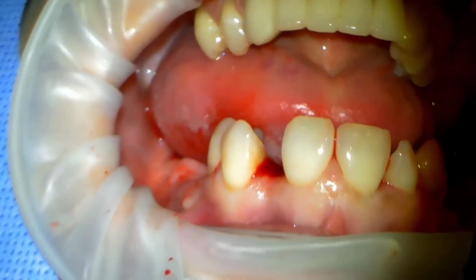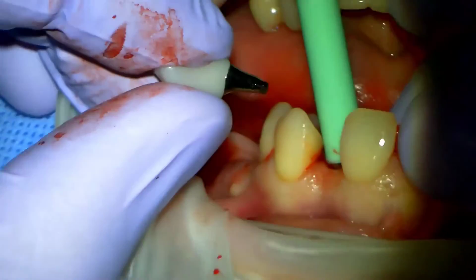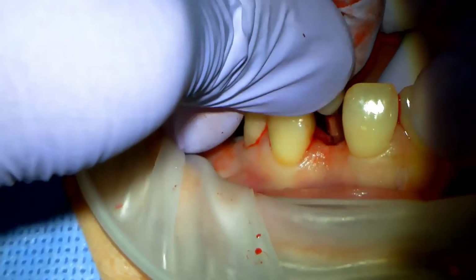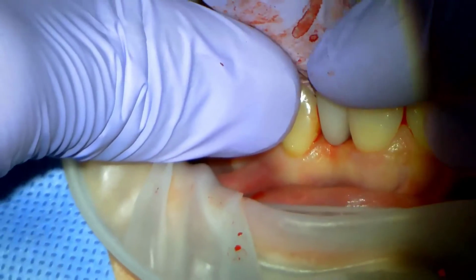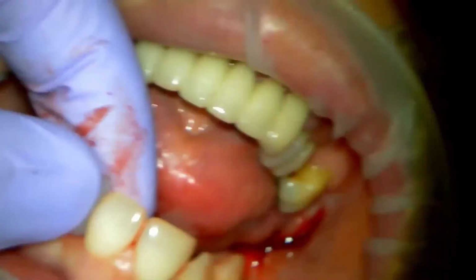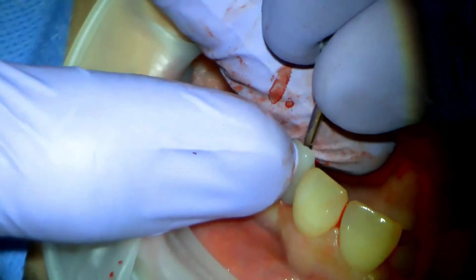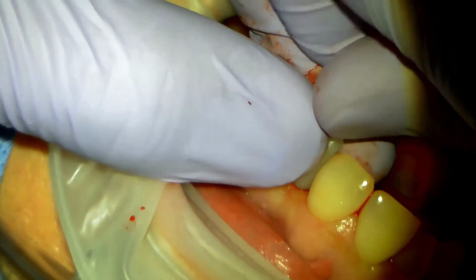I'm going to try to hold this in the right position. I'm going to hold that roughly in that position and tighten the screw and see how we're lining up.